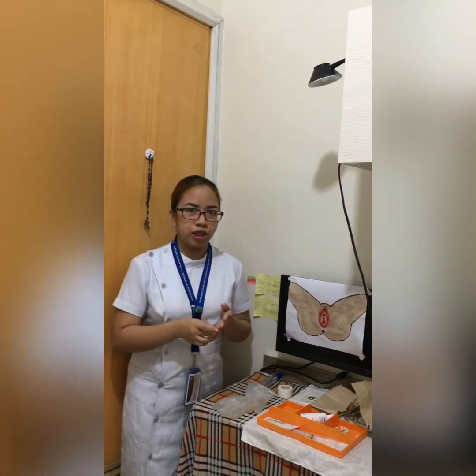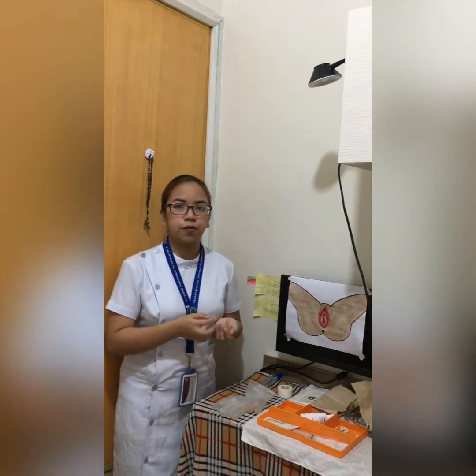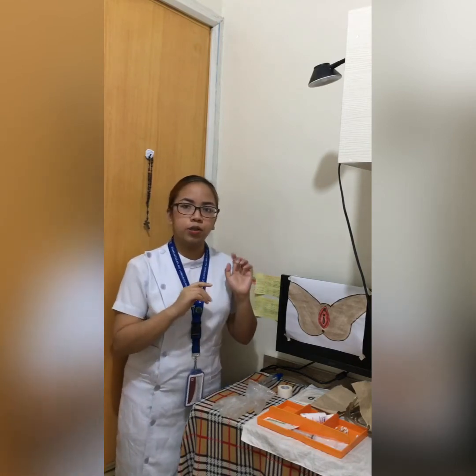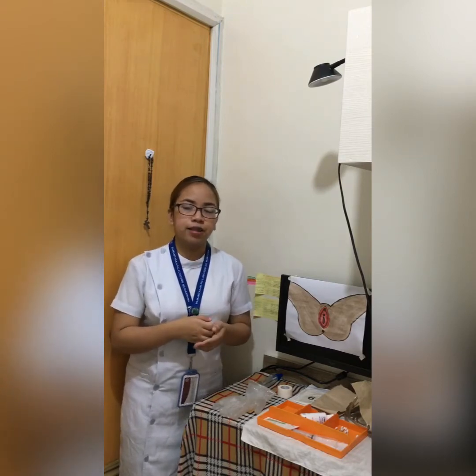Next, we have to provide privacy because the procedure is going to expose the private part of the client. So we may close the door or draw the curtains. Next is to place the client in the appropriate position so we can obtain assistance from other members if necessary.